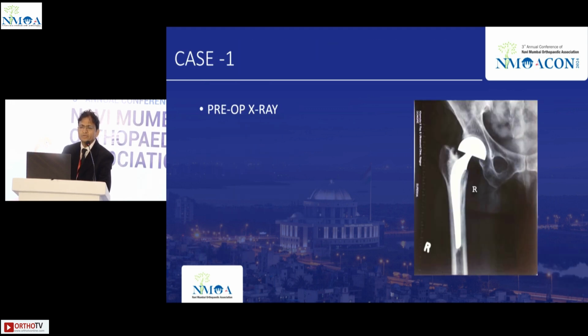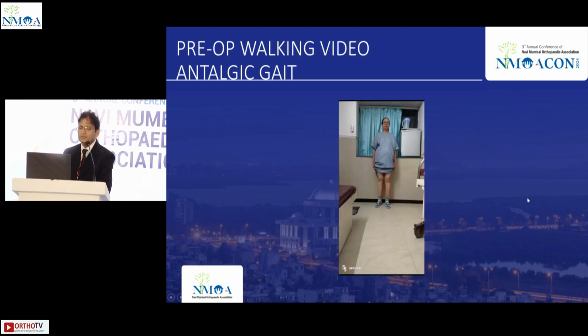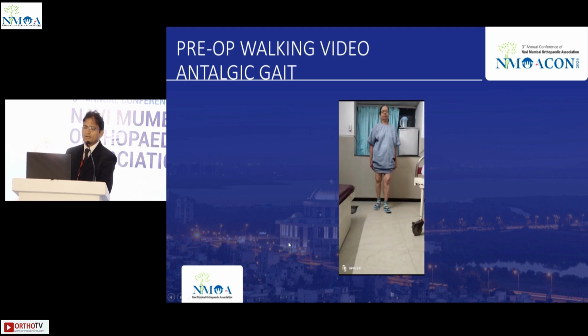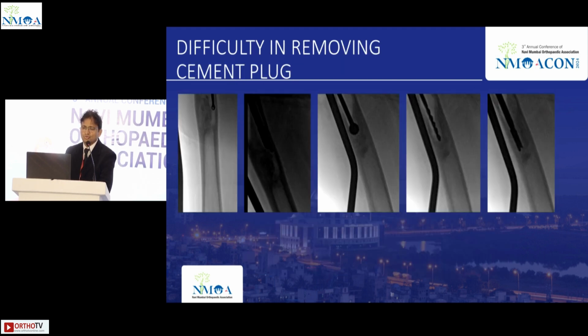So this was my own case, done around 18 years back, a well cemented bipolar, and after 18 years now you can see the difference. The lady started complaining of pain and lurch. I will show you the video of the lady, if it works. Yeah, it's working. So this was the time when she presented to us after 18 years. And the stem was loose, but the cement was not.